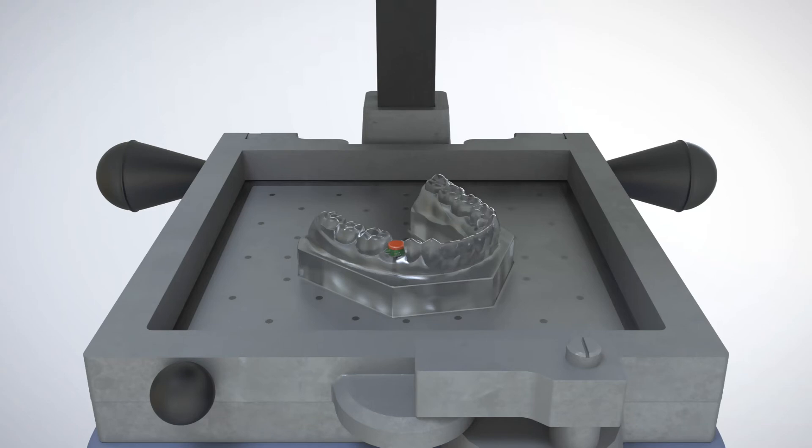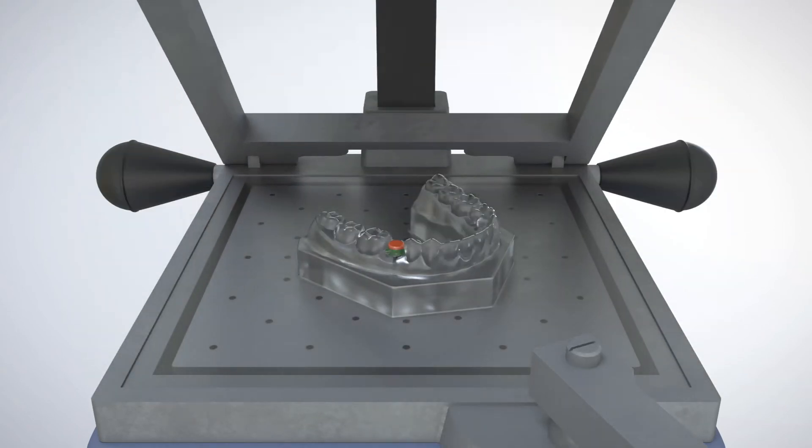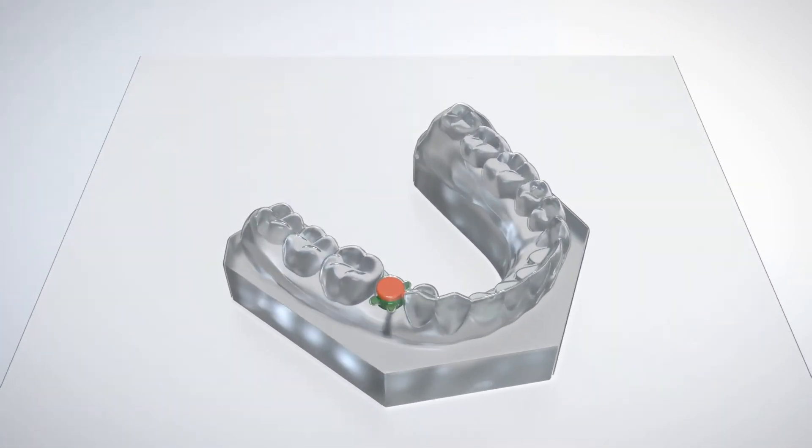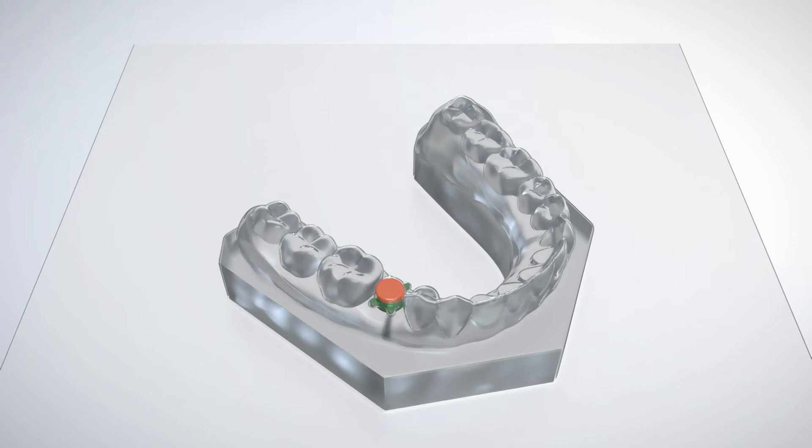The newly formed plastic GRS vacuum forming assembly and model are removed from the forming machine. Utilizing a separating disc and laboratory handpiece, the surgical guide is roughly trimmed along the free gingival margins of the teeth. A channel is cut in the plastic to remove the excess material.